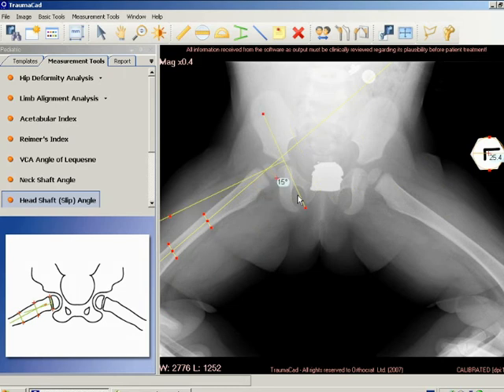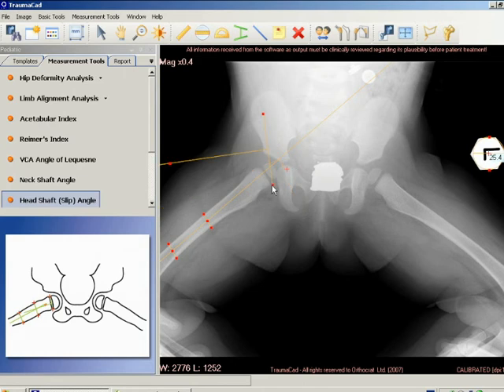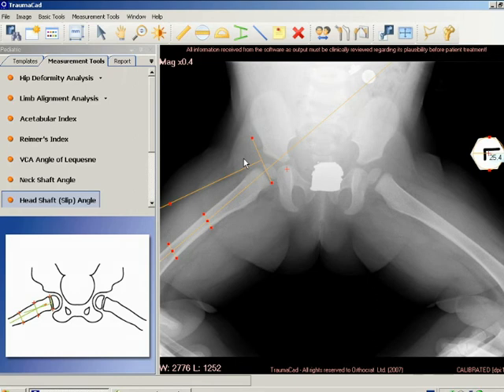It is measured for both hips, and the magnitude of slip displacement is the angle of the involved hip minus the angle of the contralateral normal hip.